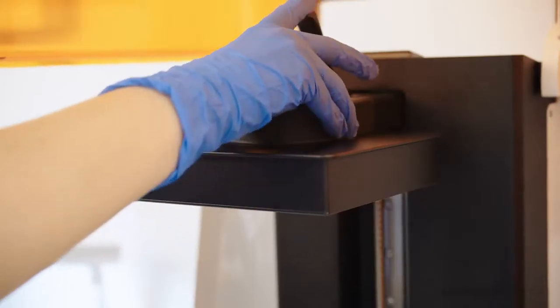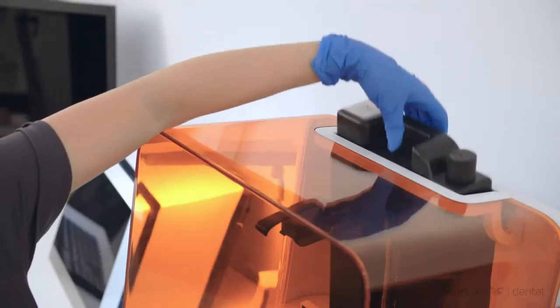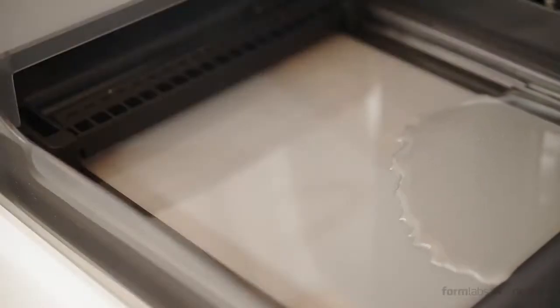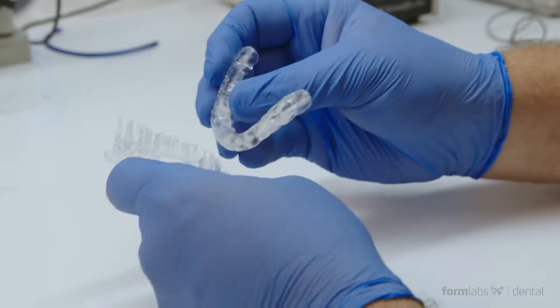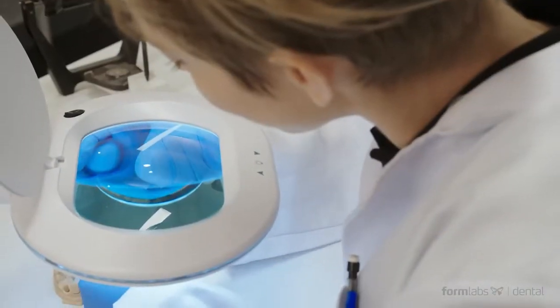The Form 3B's large build platform and automatic resin dispensing material cartridges allow for more parts per print job. Dental labs can expect to see 55% less labor and costs compared to competitive 3D printers.